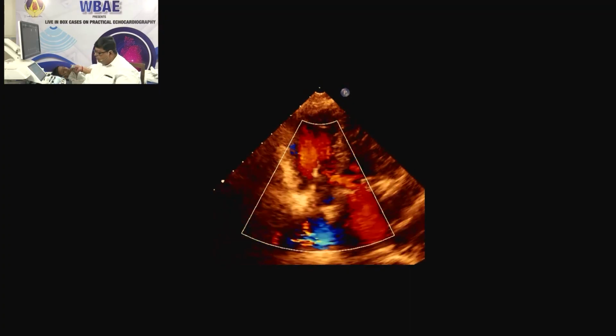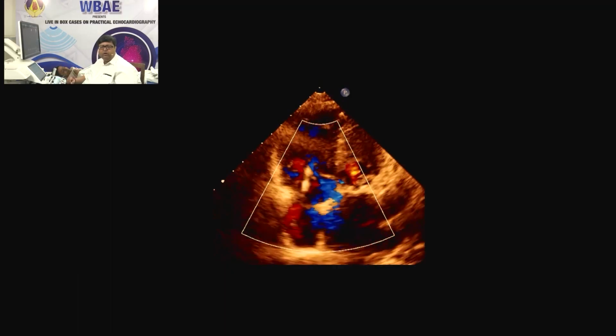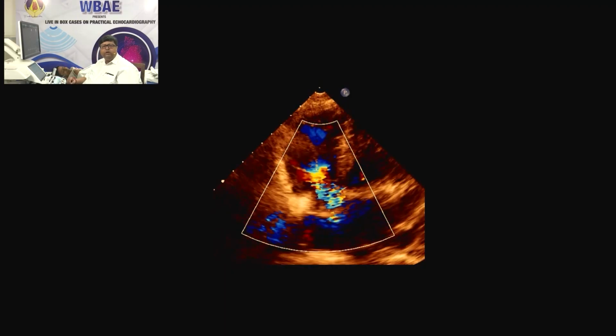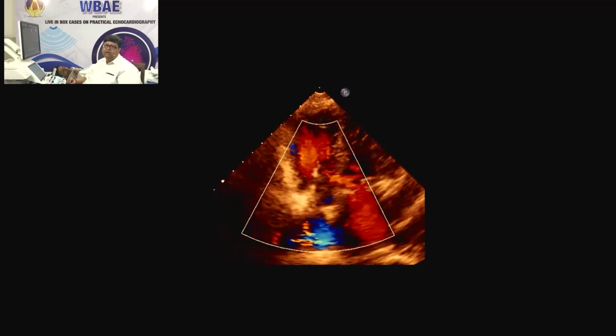To briefly summarize what we essentially see in a case of infective endocarditis when a patient is referred to us for echocardiography: the most important point is, of course, the demonstration of valvular vegetation, and the vegetation is attached to the upstream side of the valve, that is mostly the atrial aspect of the atrioventricular valves and the ventricular aspect of the semilunar valves. That's the most important point. Of course, there are atypical presentations where we may get the vegetations on the other side, but those are rare, and we can also get some non-mobile, sessile vegetations, but these are rare instances.